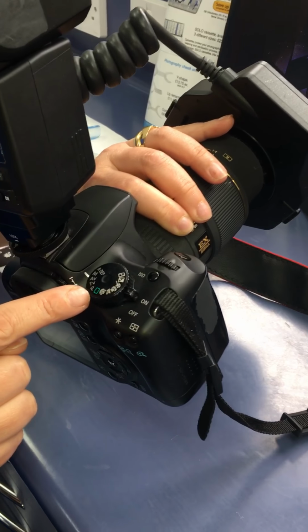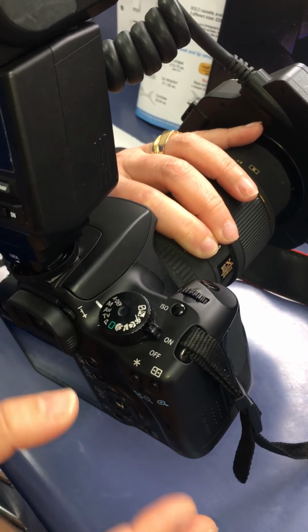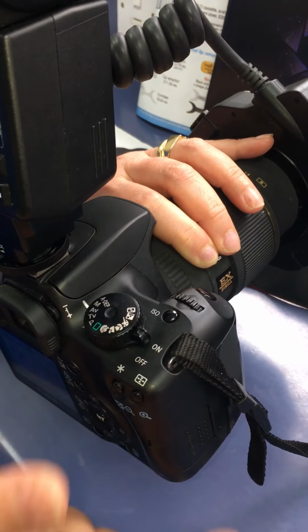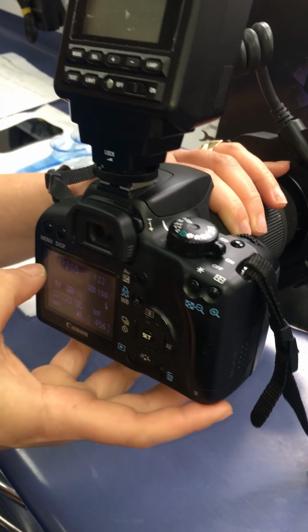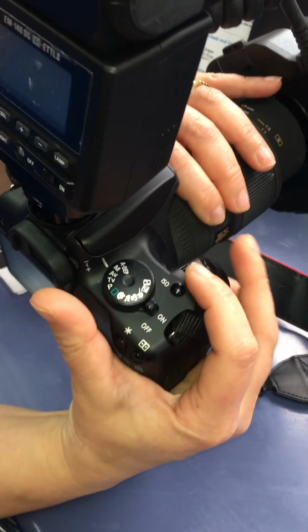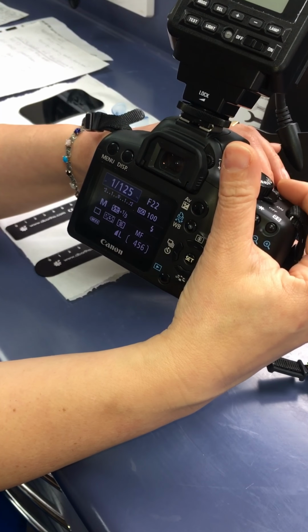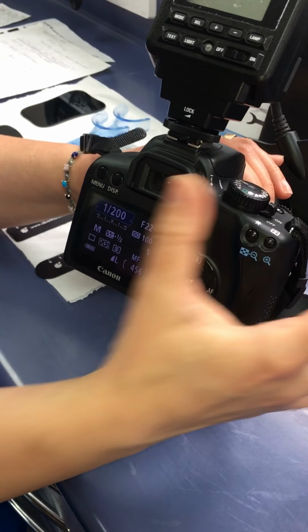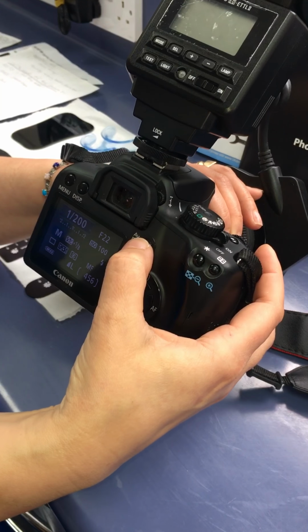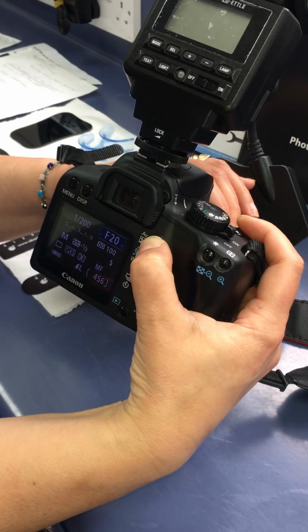The other things like P is for taking normal holiday snaps. TV is a more artistic type of snap. You're not interested in that in dentistry. If you wanted to change that setting, all you do is dial it back and forth with this dial, and you can see that the shutter speed changes, but we want it to be on 1 over 200. If you want to change the aperture, just press that and hold it, and then you can change it with the dial.